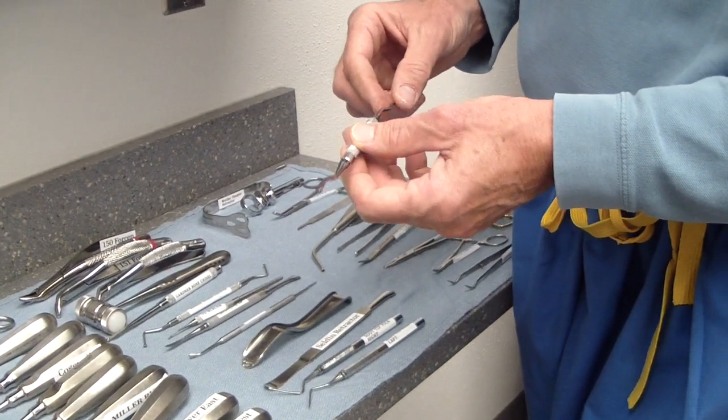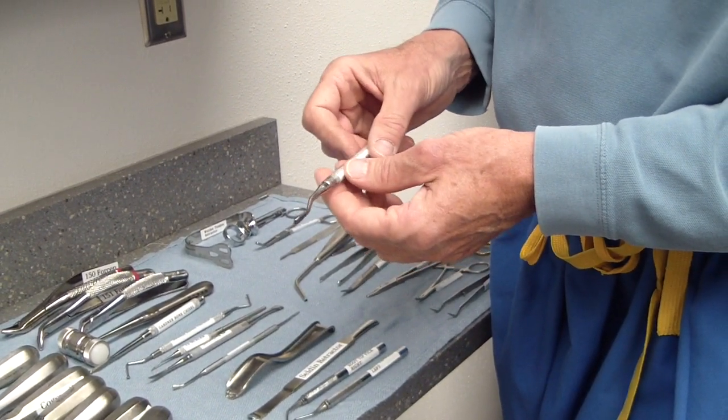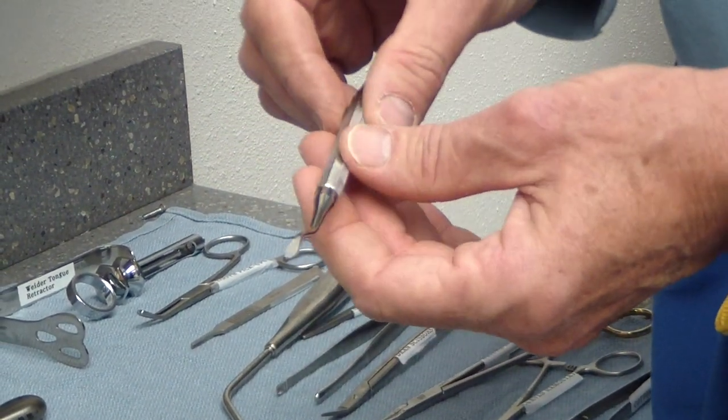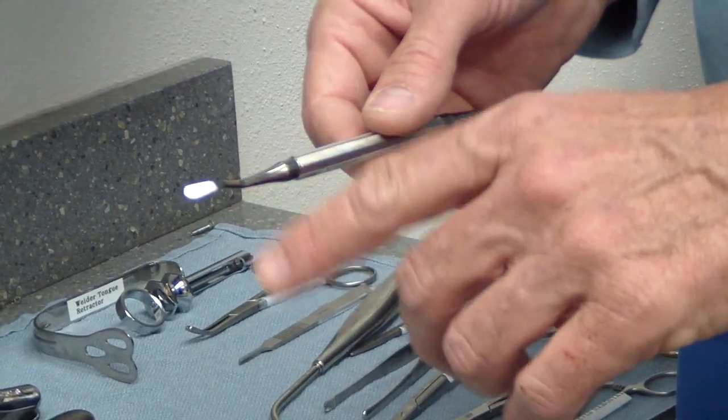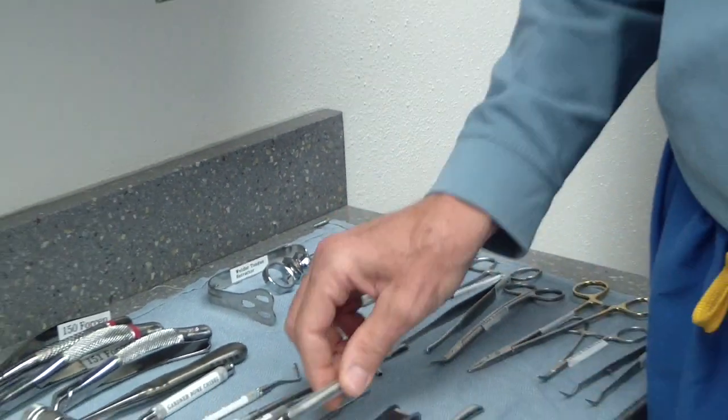Bone file. Any time I use the handpiece, I always follow up with a bone file to make sure there are no sharp edges. Also any time you have a periodontally involved ridge with irregular edges. I'll put the flap over and feel with my finger — if I feel sharp edges, I'll use the bone file to trim that down.